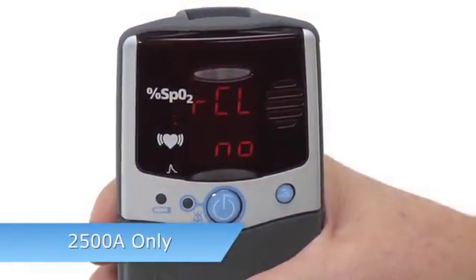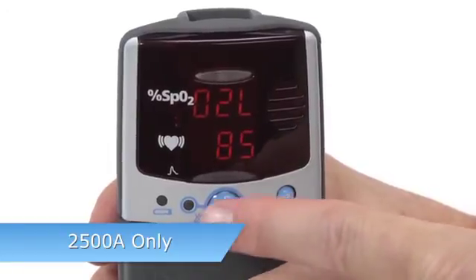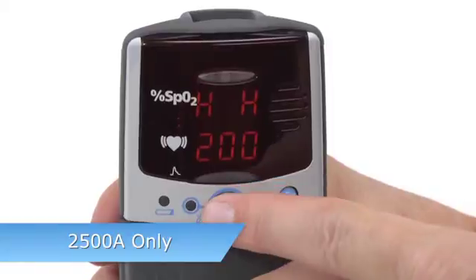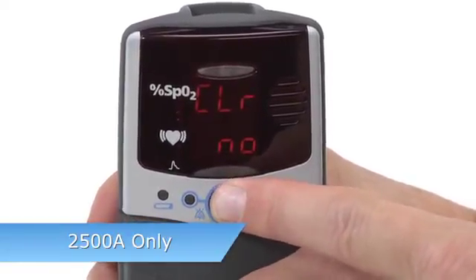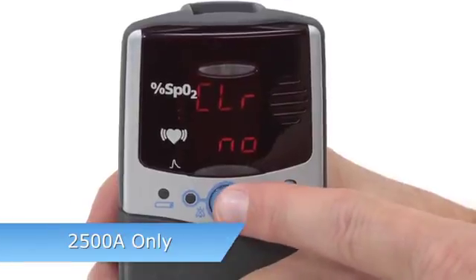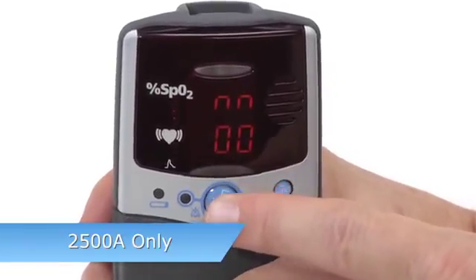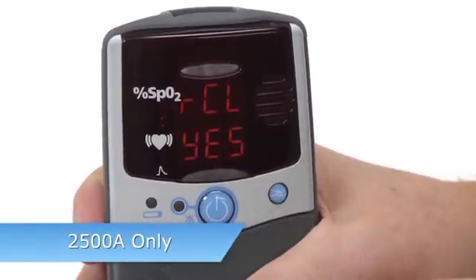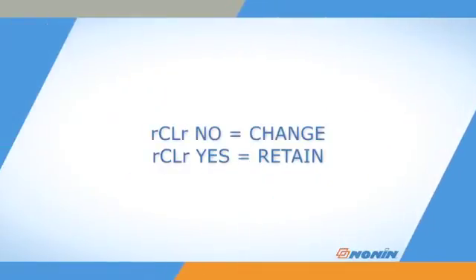For the 2500A model, when you enter Setup, the Recall alarm values NO option appears first. Memory clear and date and time settings follow after alarm settings. If you clear the custom alarm setting, the oximeter will return to its default settings. Press ON-OFF to clear the custom alarm settings, or use ADVANCE to select YES to retain the custom settings.